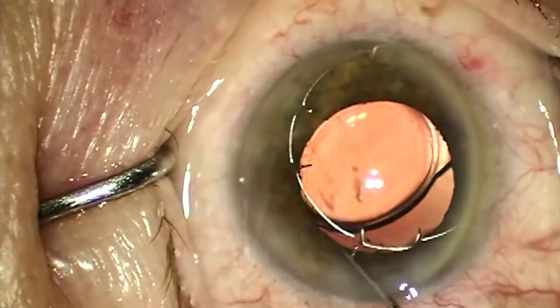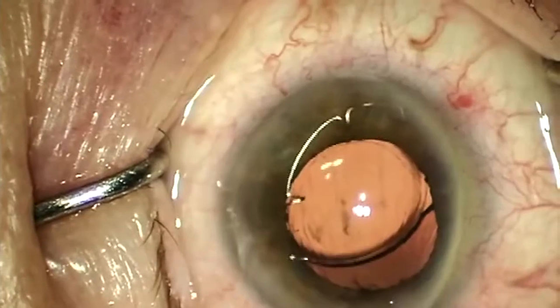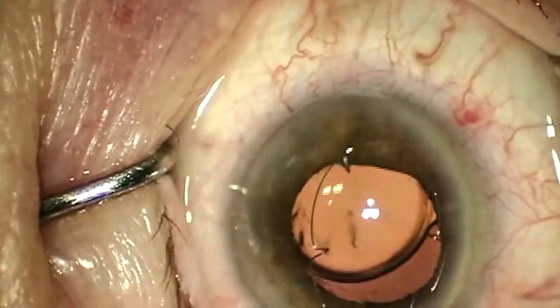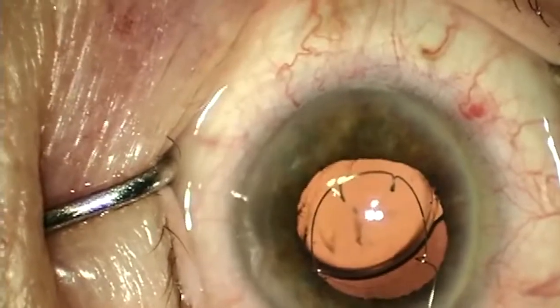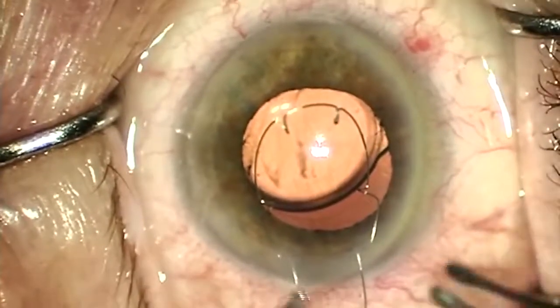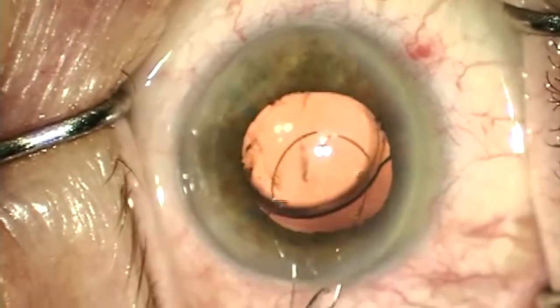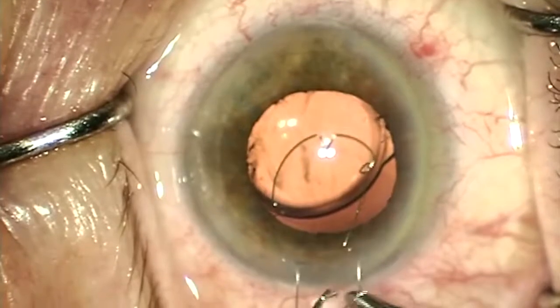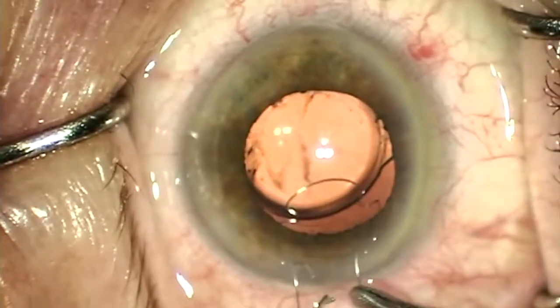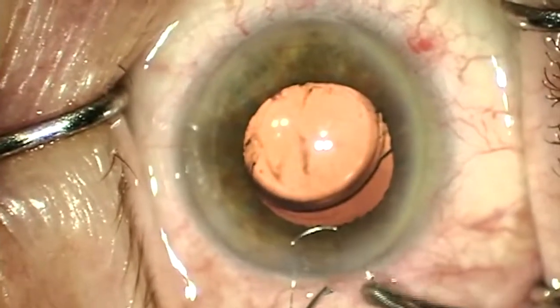While explanting the ring, the hooks will catch on the incision. This is mitigated by gaping the incision a little with the Lester hook while displacing the stuck hook medially within the incision and pulling it out again following the contour of the globe. You must follow the contour of the globe while explanting the ring; otherwise the ring may get hooked on the anterior capsule or iris.